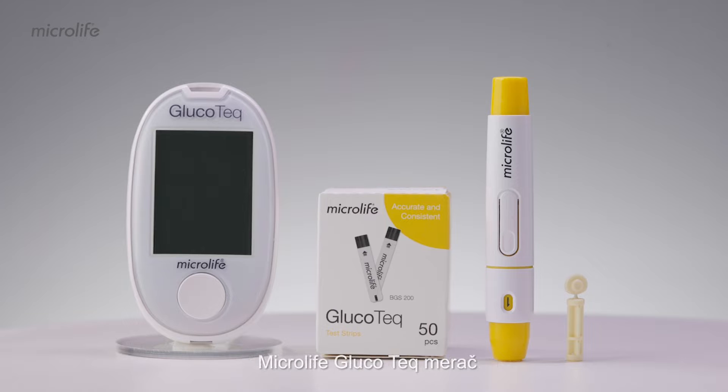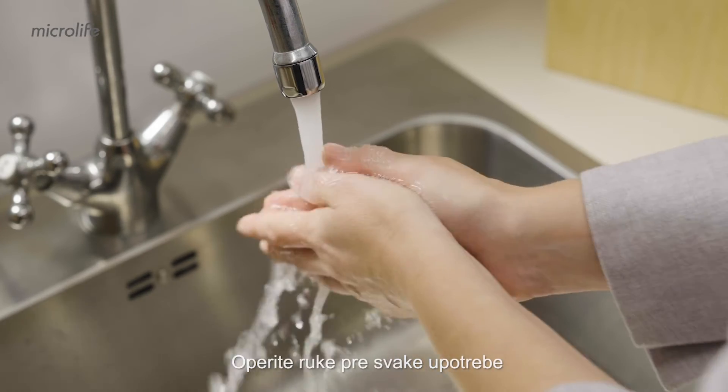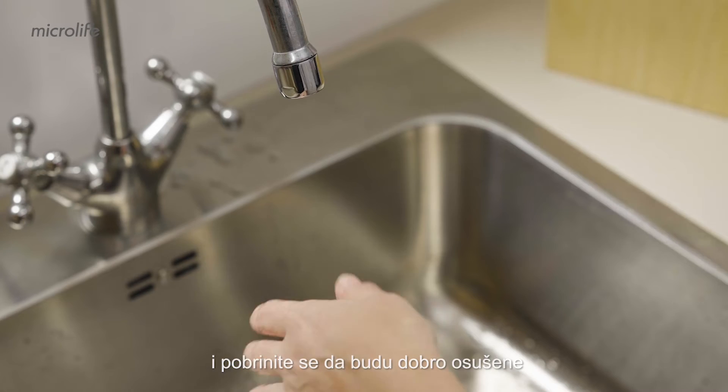Getting started, you will need the Microlife Glucotec meter, a Glucotec test strip, a lancing device, and a lancet. Wash your hands before each use and make sure they are dried thoroughly.